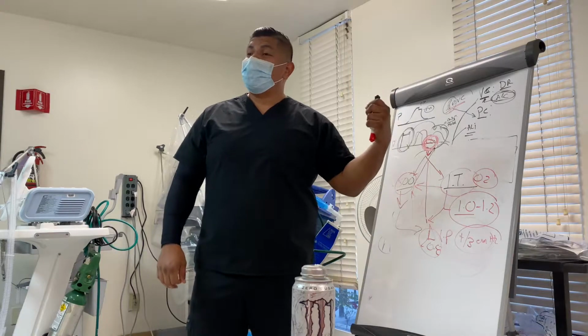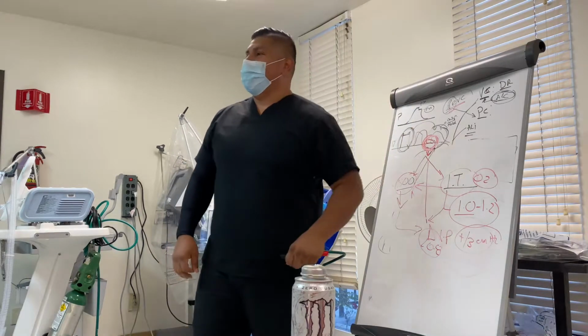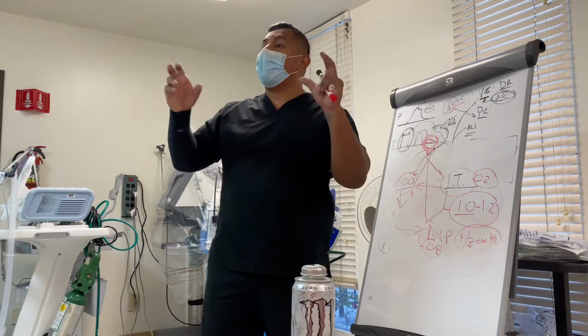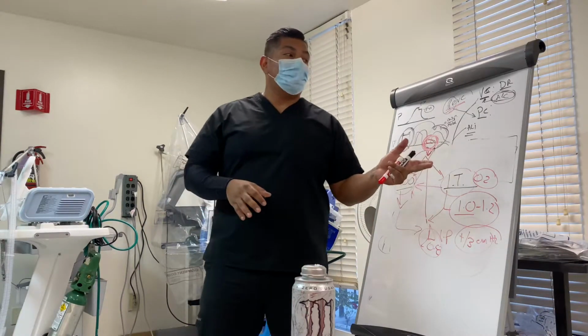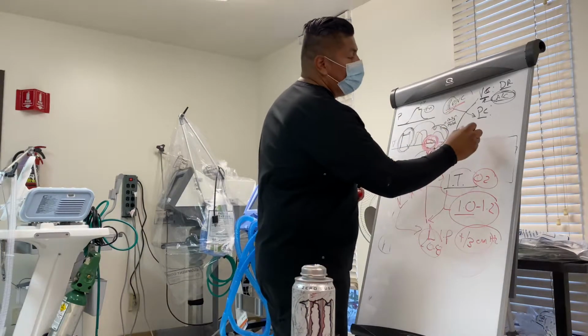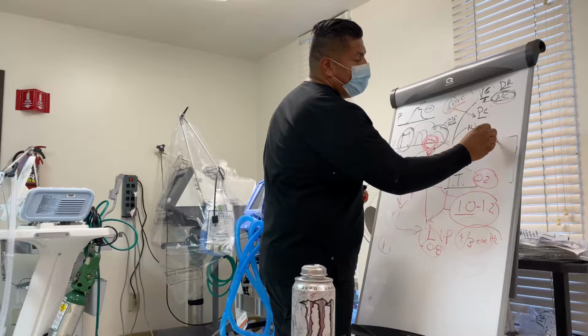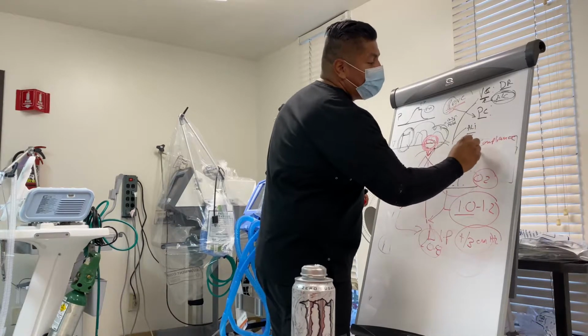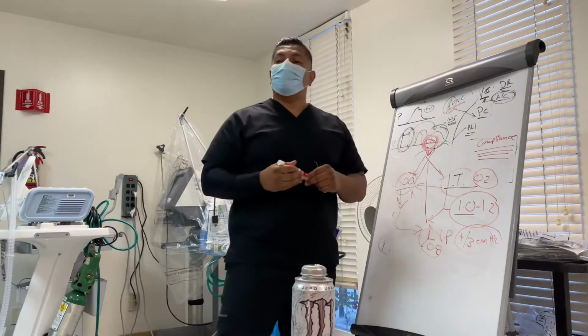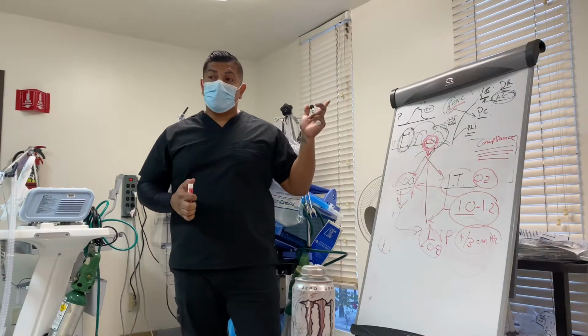This is why it's the best thing. They call this mode set it and forget it. Because you don't have to worry about adjusting any flow or inspiratory pressure. The machine will do it automatically for you, which is directly related to the patient's lung compliance. And this is going to be the determining factor of whether the patient is going to tolerate it or not.